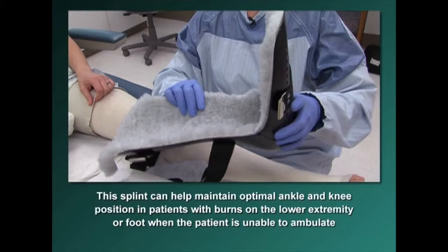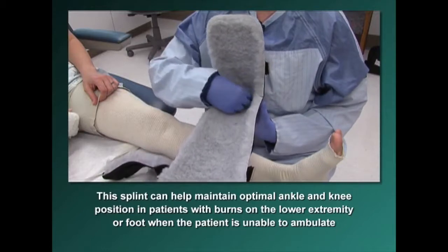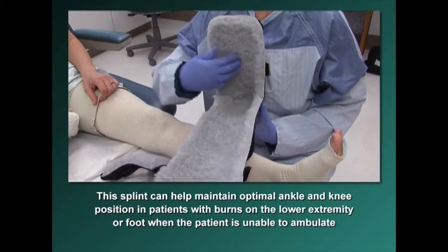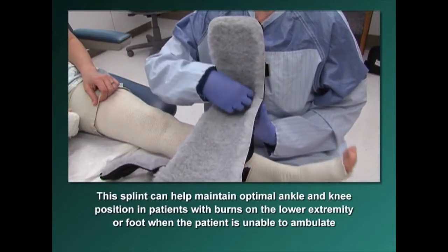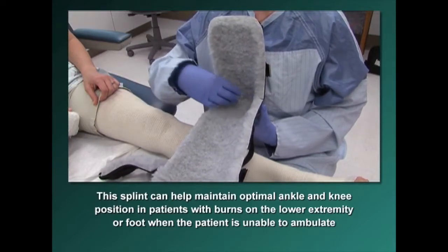The posterior foot splint can help maintain optimal ankle and knee position in patients with burns on their lower extremity or foot when the patient is unable to ambulate due to medical status, pain, or noncompliance. This splint has a really deep hole for your heel because we don't want your heel pressing against anything — when you put your foot in, you need to make sure it is floating in that area.